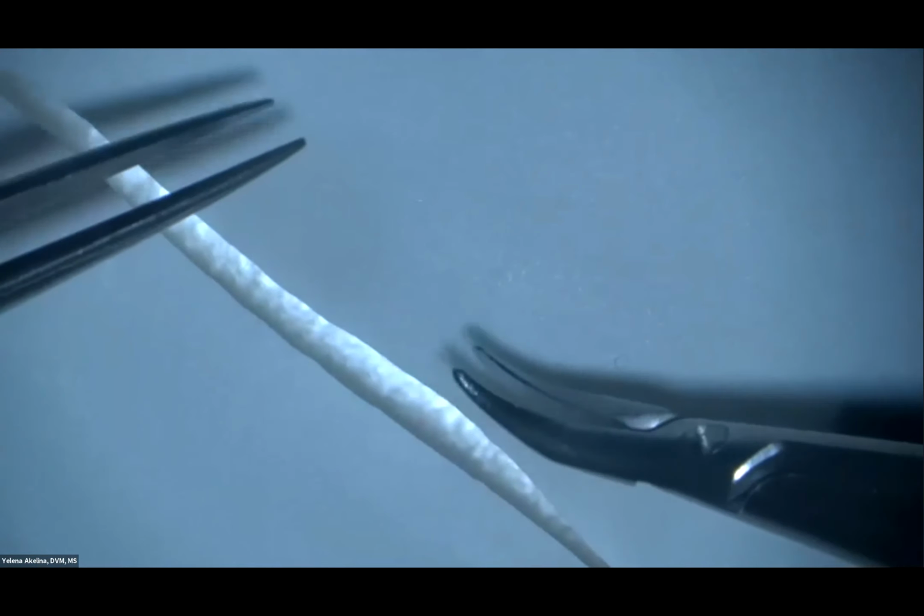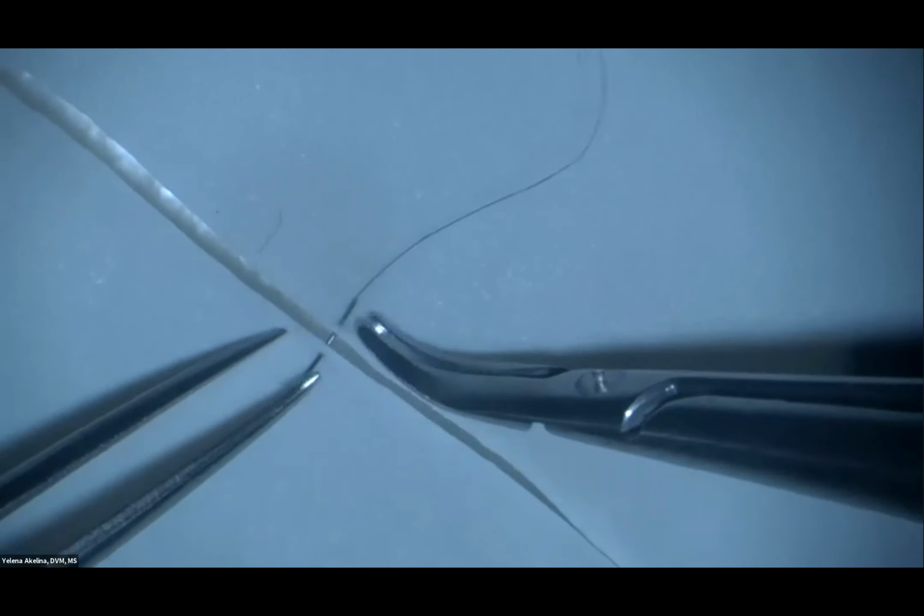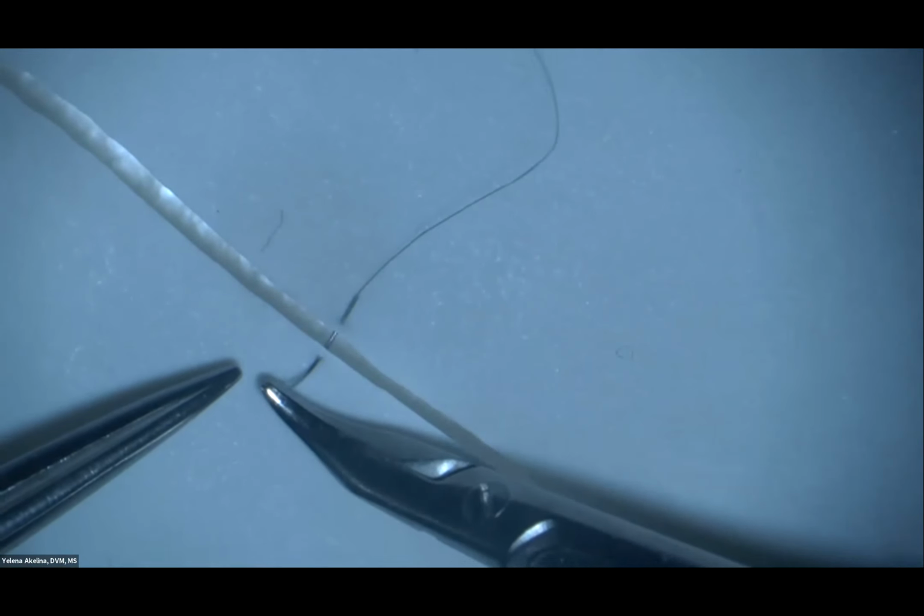The glove is a little bit too tight, so I'm adjusting the tissue a little more. Yeah, a glove is a very rude model for practicing, but it works fine for the beginning. So small bites, again: lift up on the tip of the needle, push the needle all the way through, and pick it up with your dominant hand. Do not ever touch the tip of the needle. Use the shaft, grab it and pick it up.